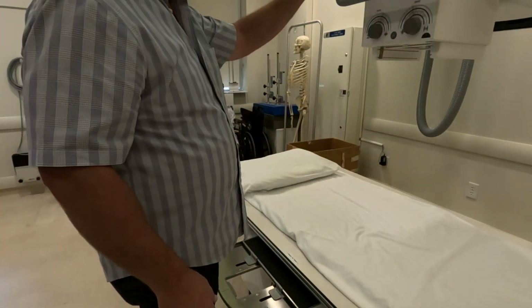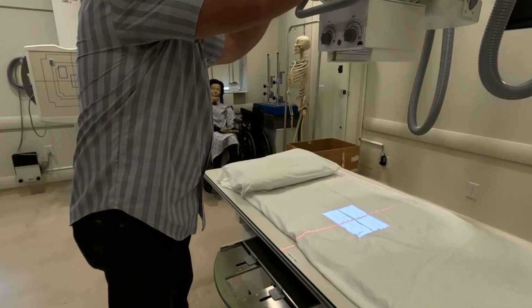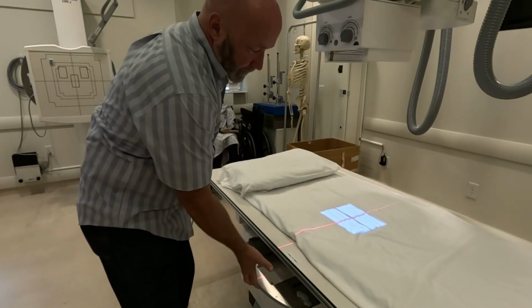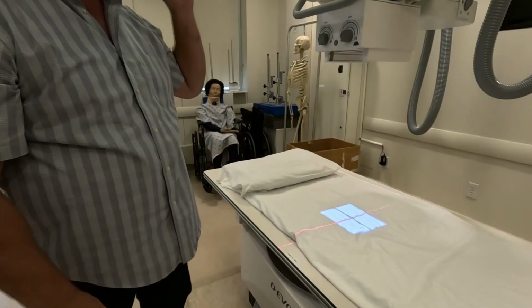That's a matter of personal preference. But you can move until the two are lined up. You see the laser, it points to these little dots indicating the center of the image receptor. Now you're aligned. From this point, you don't want to touch either the image receptor or the X-ray tube.